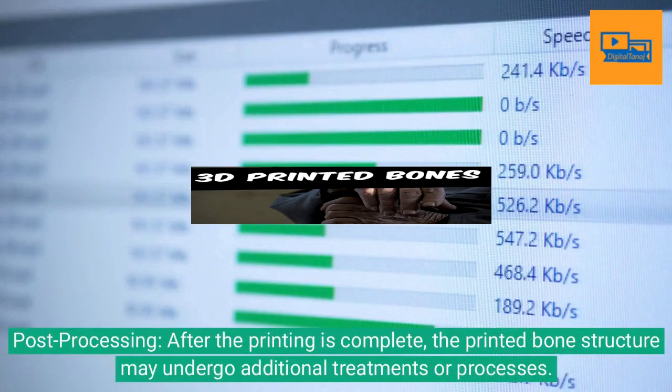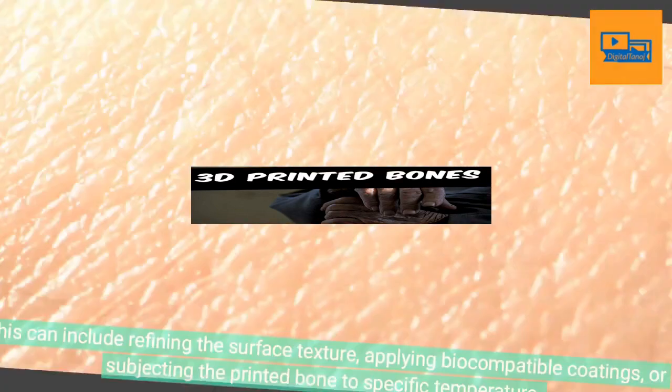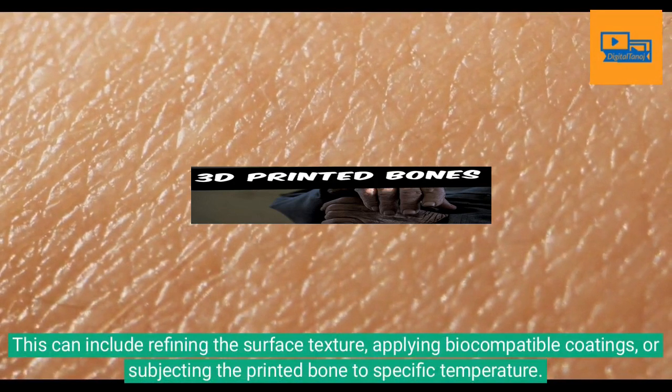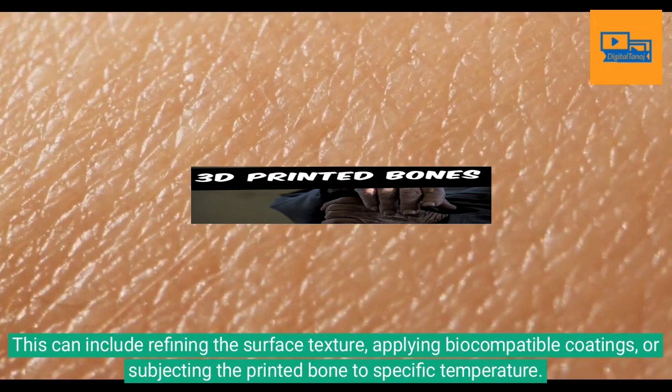Post-processing. After the printing is complete, the printed bone structure may undergo additional treatments or processes. This can include refining the surface texture, applying biocompatible coatings, or subjecting the printed bone to specific temperature.